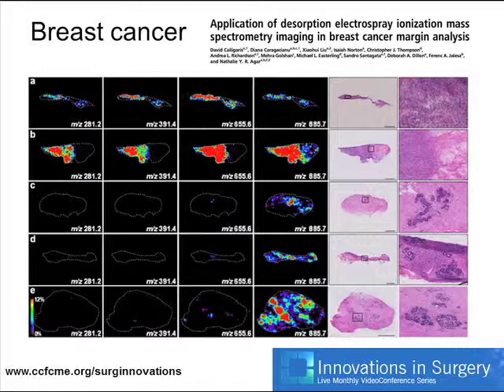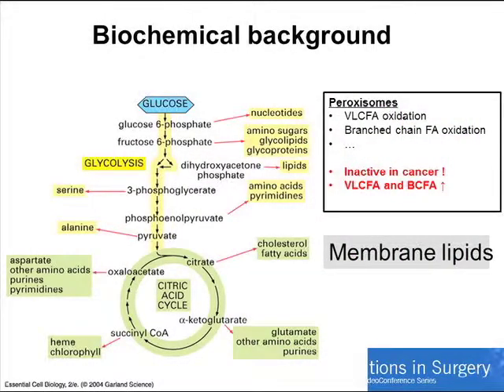That took us on to trying to understand why we see these changes, and what we're predominantly measuring, next slide please, is the cancer lipidome, the changes in the mucosal lipidome. You'll all be aware of the Warburg effect in cancer. Well, as part of this, what we see is changes in membrane expression of lipids. If you can just run through to the next slide, please.